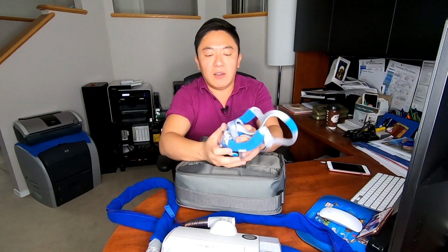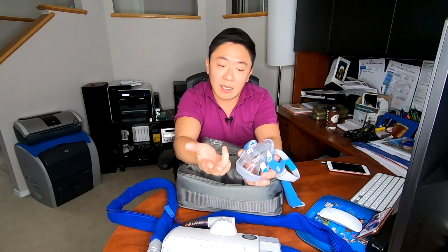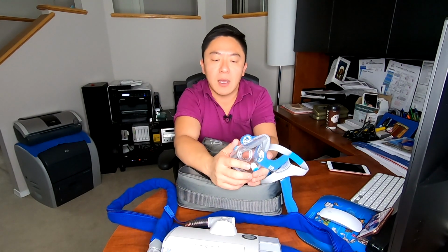And then we've got the face mask. Now, the style I've got here is a ResMed AirTouch F20 series full face mask. I use a full face mask because I am mostly a nasal breather, but when I have nasal congestion, I tend to end up breathing out of my mouth. And it's unfortunate because I actually do have some pretty jammed up sinuses all the time, so that's why I use this. You can actually get a nasal mask, which goes over the nose, or you can get nasal pillows, which go against your nose, or a variation hybrid mask, which I will get into here.